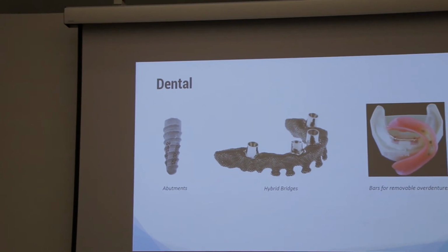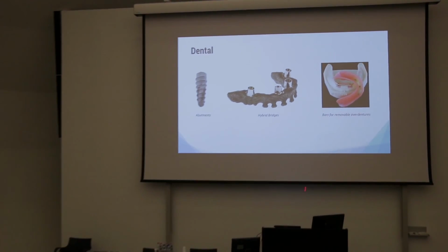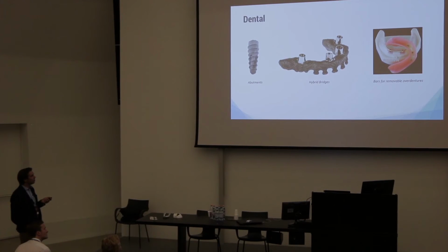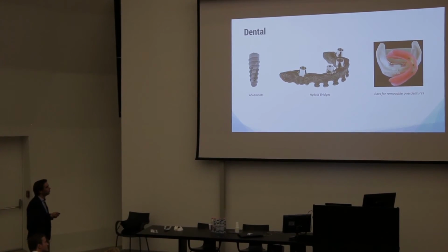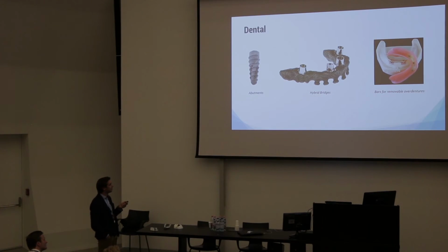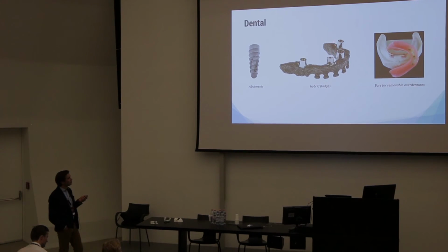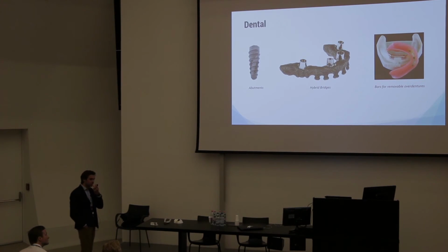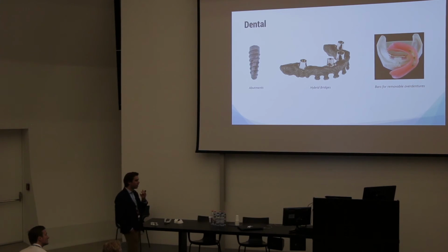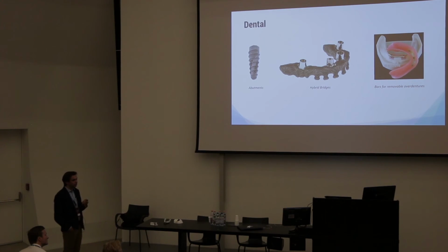These bridges are actually a very nice application of not only 3D printing, but the complete process flow, where we have a cobalt chrome alloy, which is specific to the dental market to meet the thermal expansion coefficient of the ceramics that get baked on top of this implant to prevent the final dental implant from cracking, and this is 3D printed. But these implant connections, which have to be very high accuracy to ensure a good implantation to the patient's skull and thereby a good bite, will then be CNC machined afterwards to provide that necessary accuracy.